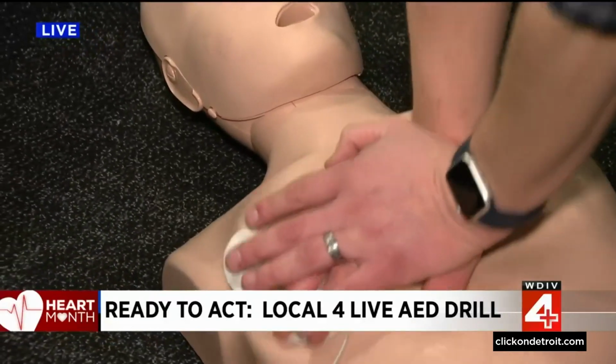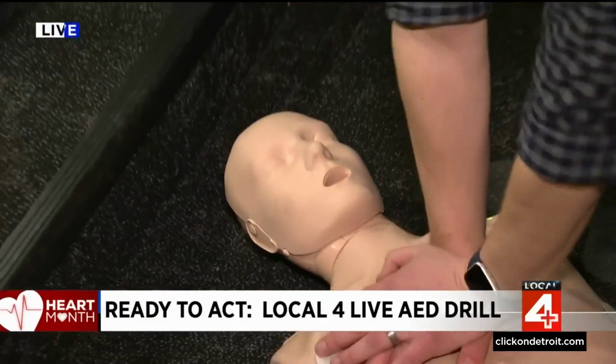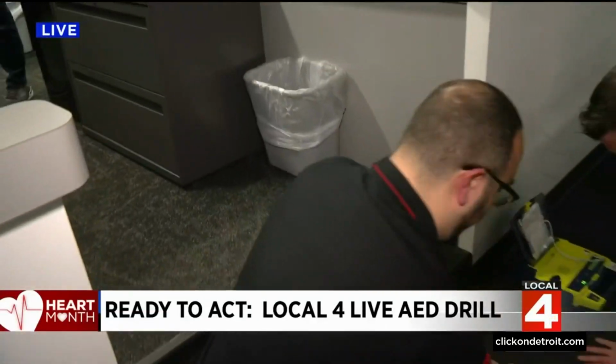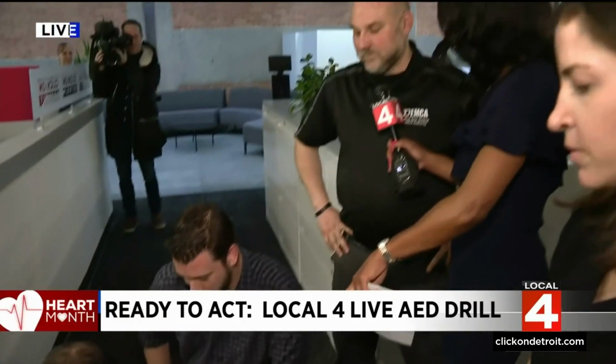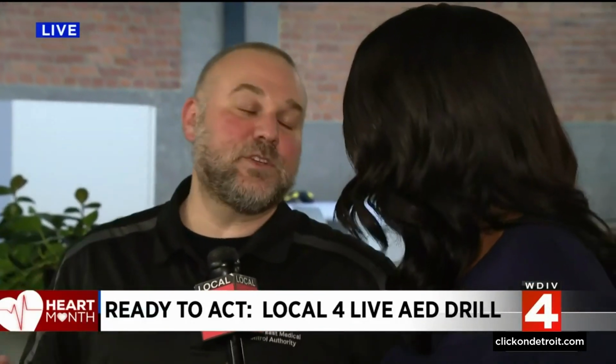So we did start the hands-only CPR. After that, we did have someone call 911. Then someone went to go get the AED. And what you're saying is that 4th step is to make sure someone is meeting with EMS. And right now, I don't see that that's happening. That is essential, especially in a building like this, because you guys have 5 different entrances out there. EMS is not going to know which entrance to come into. All right. And especially to guide them back here, because you think how easily you can get lost in this maze.